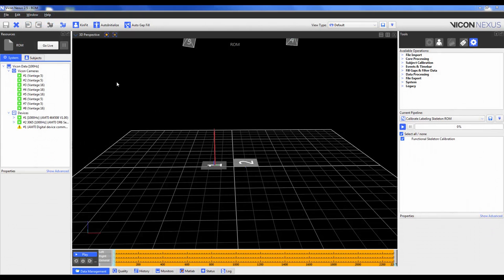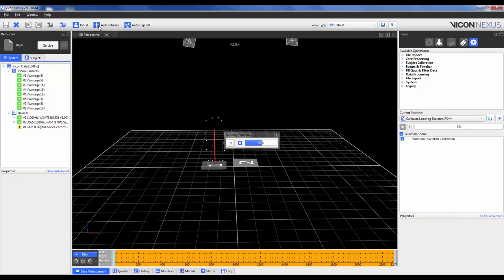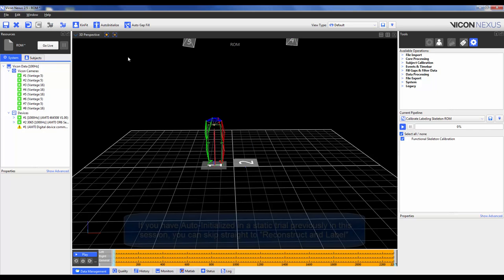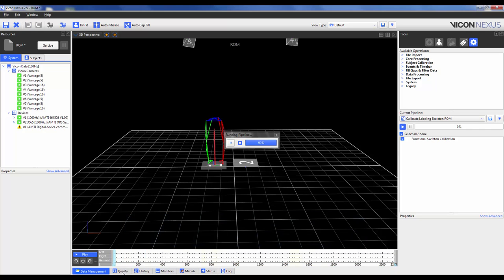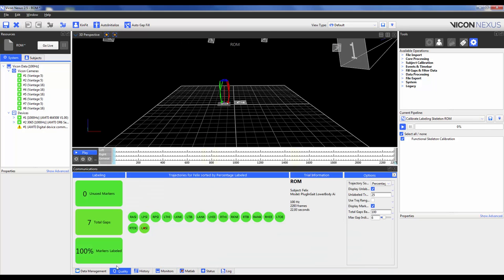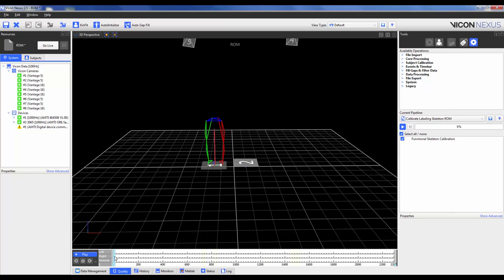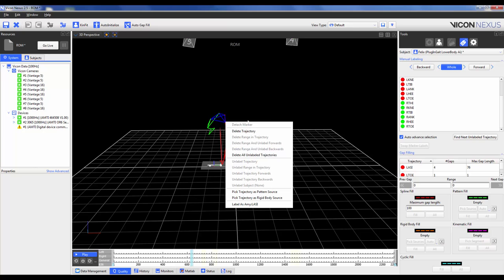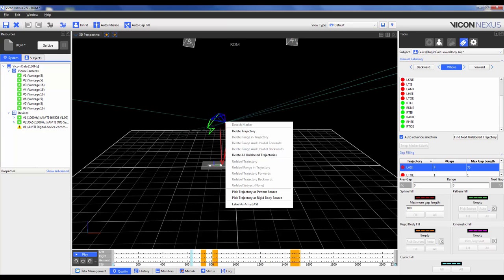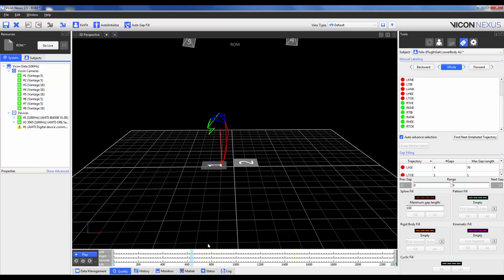To process the ROM trial, go ahead and open it and replicate the steps for the static trial, that is to reconstruct and then auto-initialize. We're going to add in an extra step here which is to then reconstruct and label. We can then quickly go into the quality tab and look to see if any of our markers are labeled. If they were, we can go ahead and scrub through the trial and apply the labels within either label edit or right-clicking on the marker and then going to the bottom of the list and seeing which marker was not labeled.